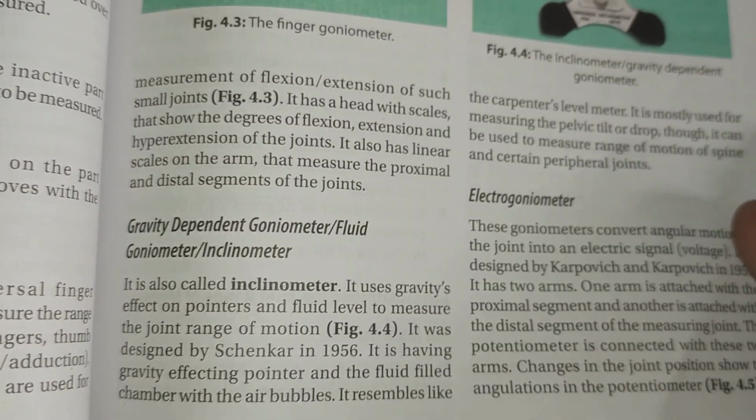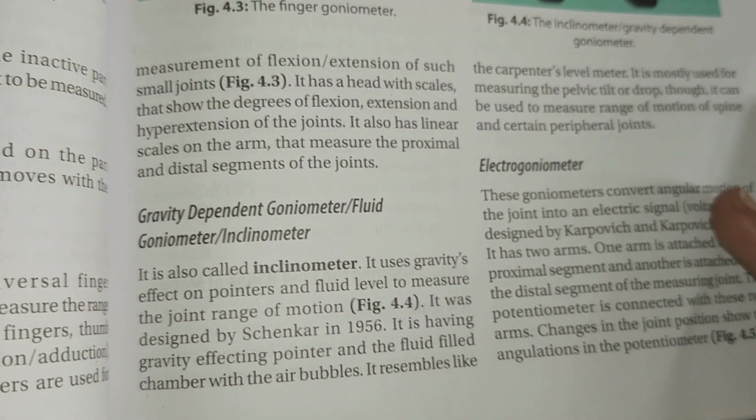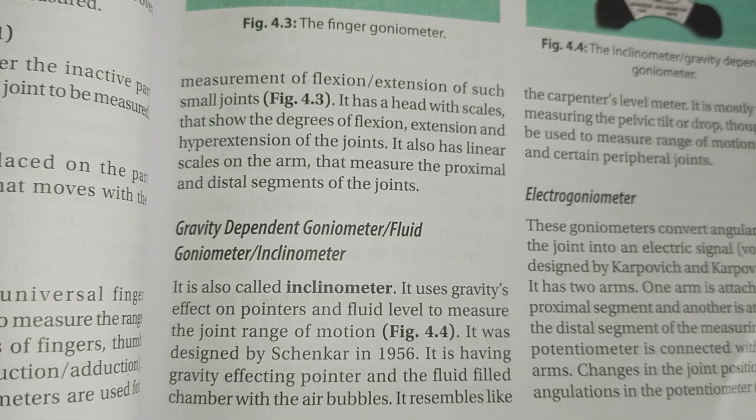Next, the gravity dependent goniometer or fluid goniometer. It is also called an inclinometer.